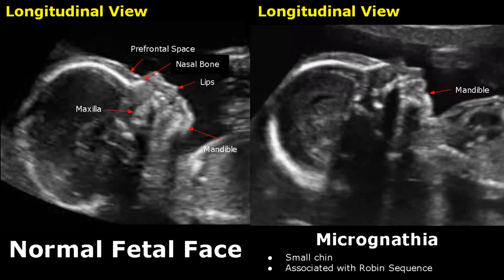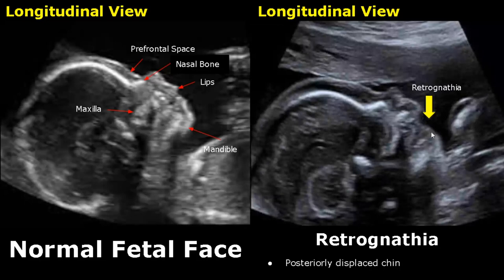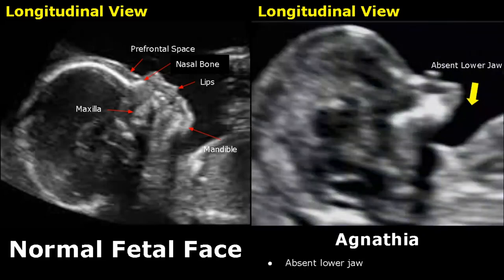Micrognathia refers to a small chin — it can be difficult to diagnose because it can be subtle. Here we can see a small chin that is not leveling with the upper jaw. In retrognathia, the chin is displaced posteriorly, and it is difficult to diagnose on ultrasound. In agnathia, the lower jaw is absent — in this image, the lower jaw is not seen; it is missing.